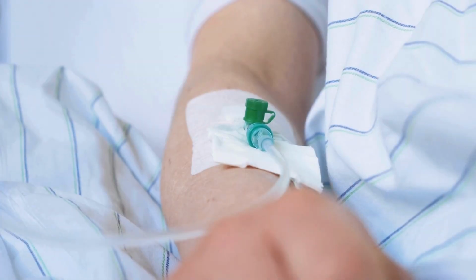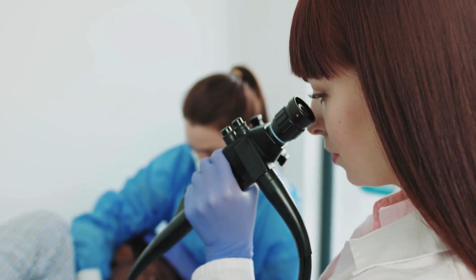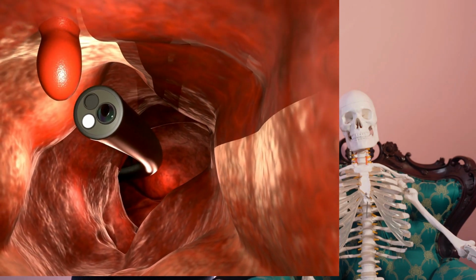Who knows what's next? Speaking of what else, what can I expect during this procedure? You will be given fluids and medications through an IV line, which will maybe make you feel relaxed or even sleep a little bit during the test. The colonoscope is a long, flexible tube which will be inserted into your colon, and air or carbon dioxide will be pumped into the colon to help visualize the linings. Biopsies or polyp removal may also occur during the procedure. The nice thing about colonoscopies is that they are both diagnostic, they can find out if you have a problem in the colon, and therapeutic. If there is something bad, it can be taken out in the moment.